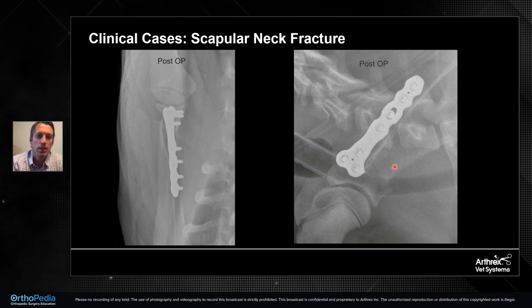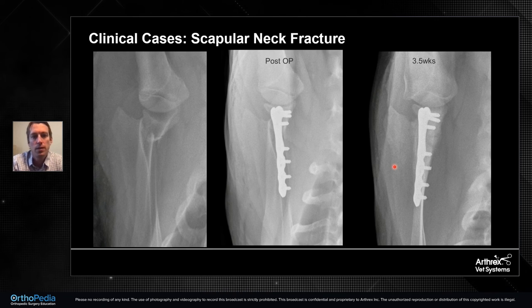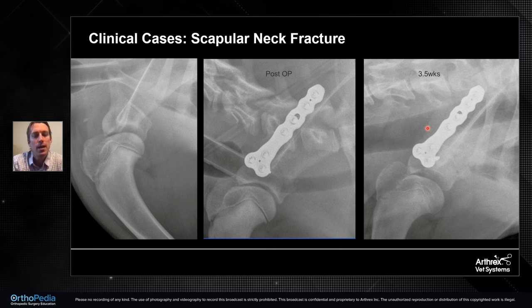So there's the postoperative repair from the AP and lateral view, and then just some follow-up x-rays of the original post-operative reconstruction, and then early callus formation and healing at 3.5 weeks. This dog had been in the canal, I think, 3 to 4 times swimming with its spica splint on. So we took it out of the spica at that 3.5 week mark. This is just the lateral views showing early fracture healing at that 3.5 week mark, as well as placement of the plate.